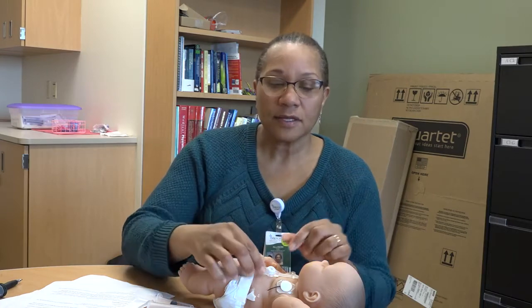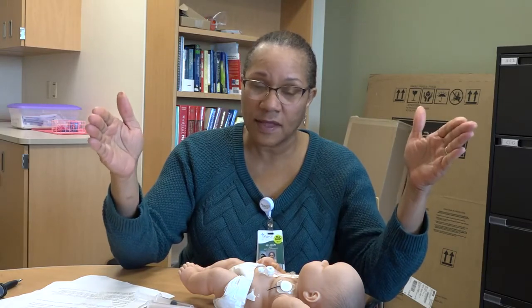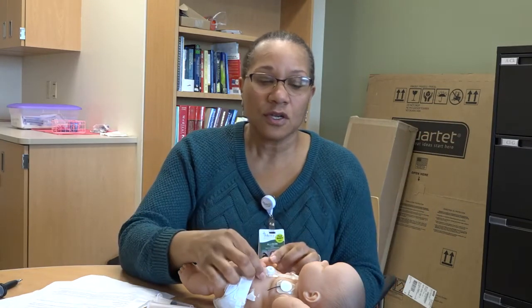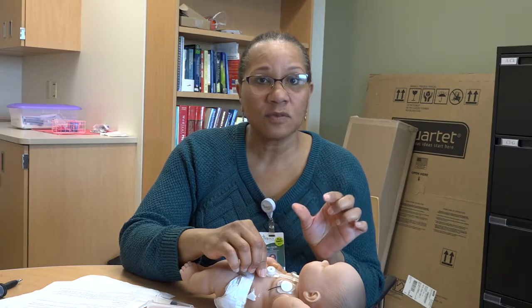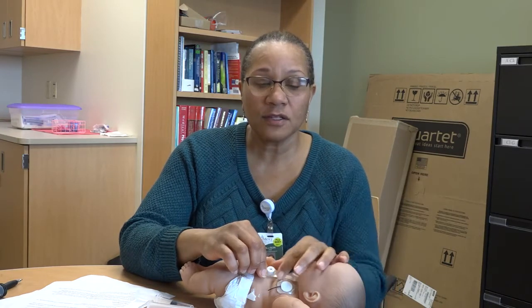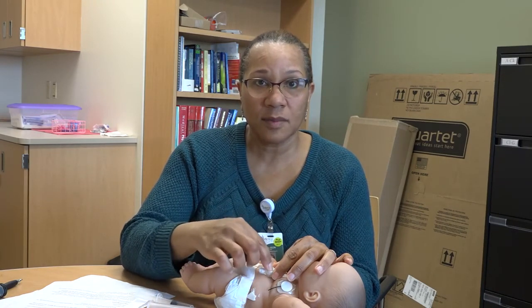And then speak to that surgeon on call, and they will let you know what they would like for you to do, okay? But you won't be able to replace the tube yourself if it's within these first 3 months and they haven't had their first official tube change. Usually we have you come to the emergency room, and it is replaced in the emergency room. And the reason why we need to do that is because we need to check it and verify placement by a test in radiology, where they put some dye through the G-tube and make sure that it is actually in the stomach.